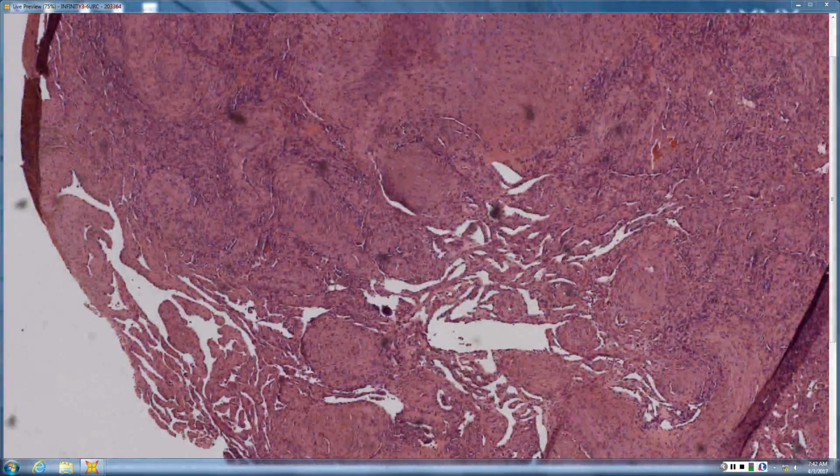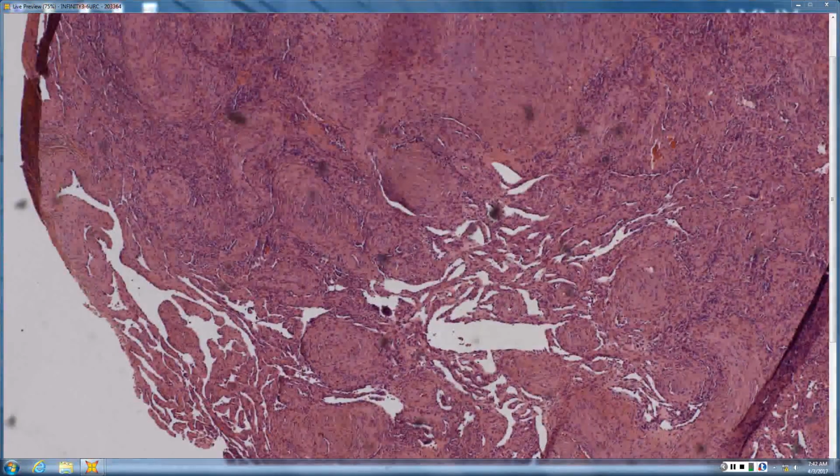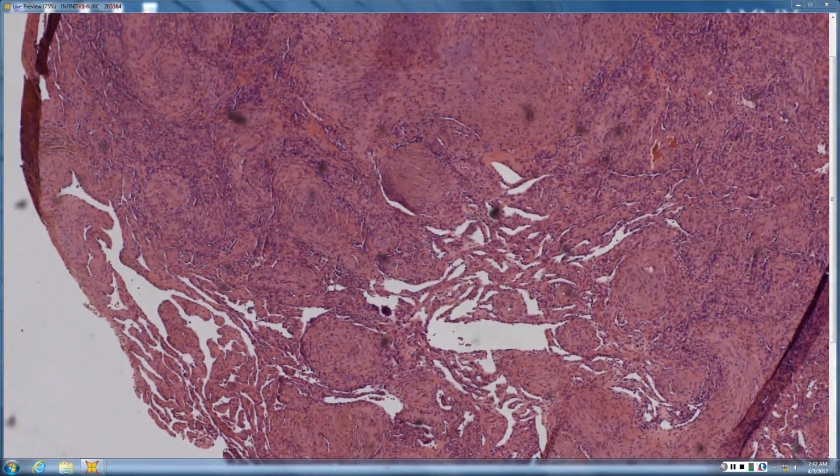So there's spindle cell hemangioma. Tell me about spindle cell hemangiomas. What are they supposed to look like? And the old name is spindle cell hemangioendothelioma. Right, same thing. In a hemangiopericytoma, they are spindly, but they have more like clear space in them, basically. I mean, they're still spindle.